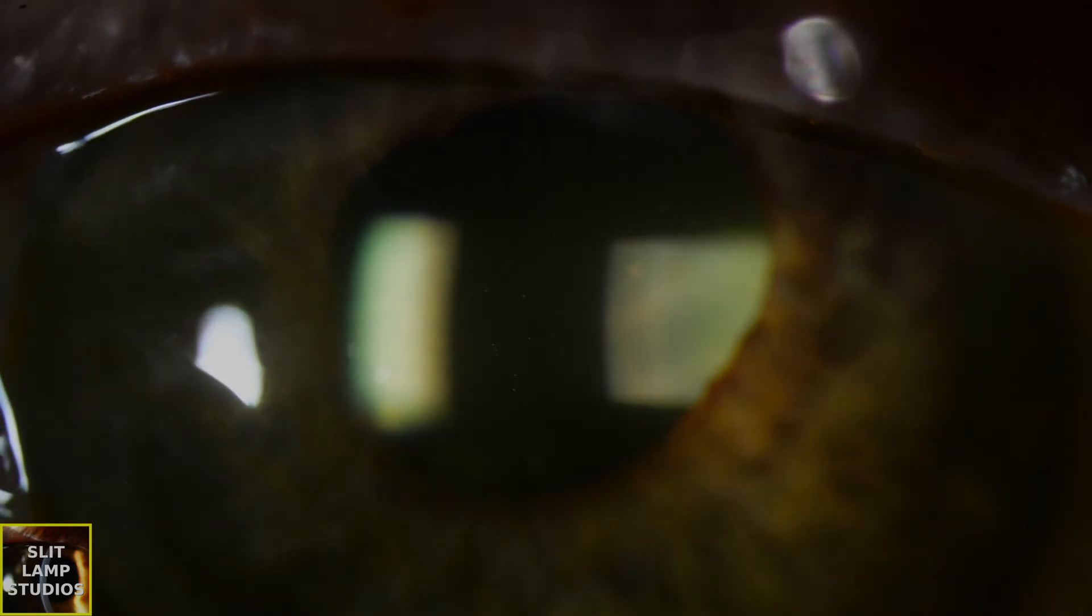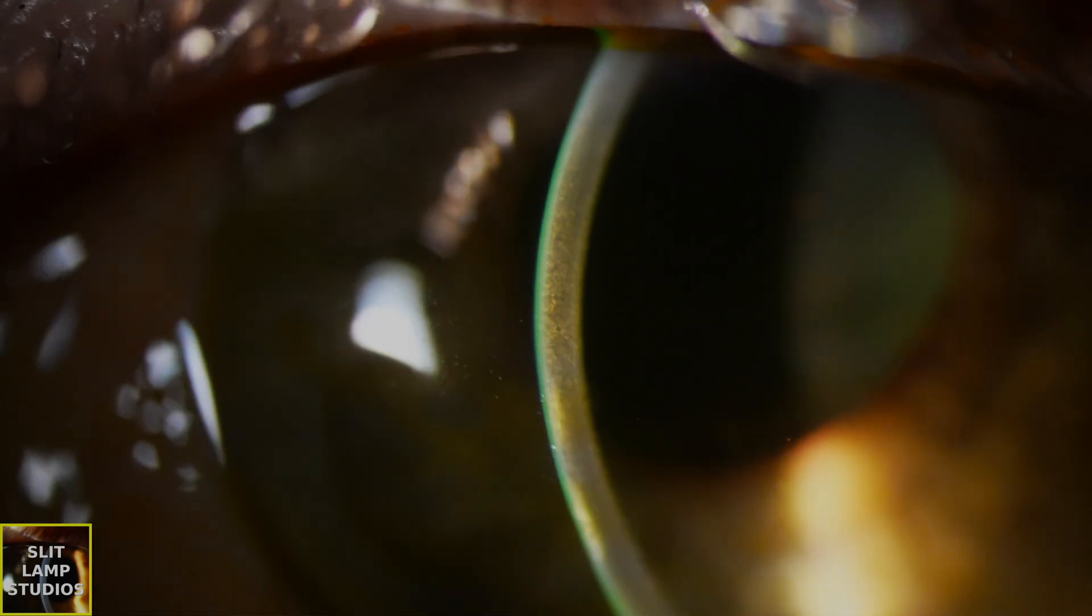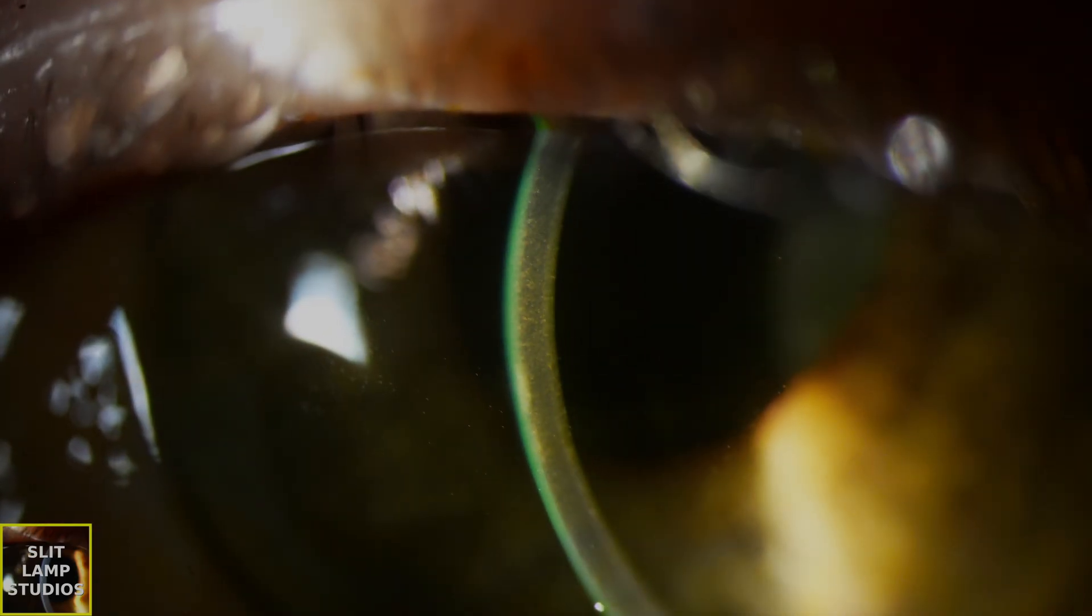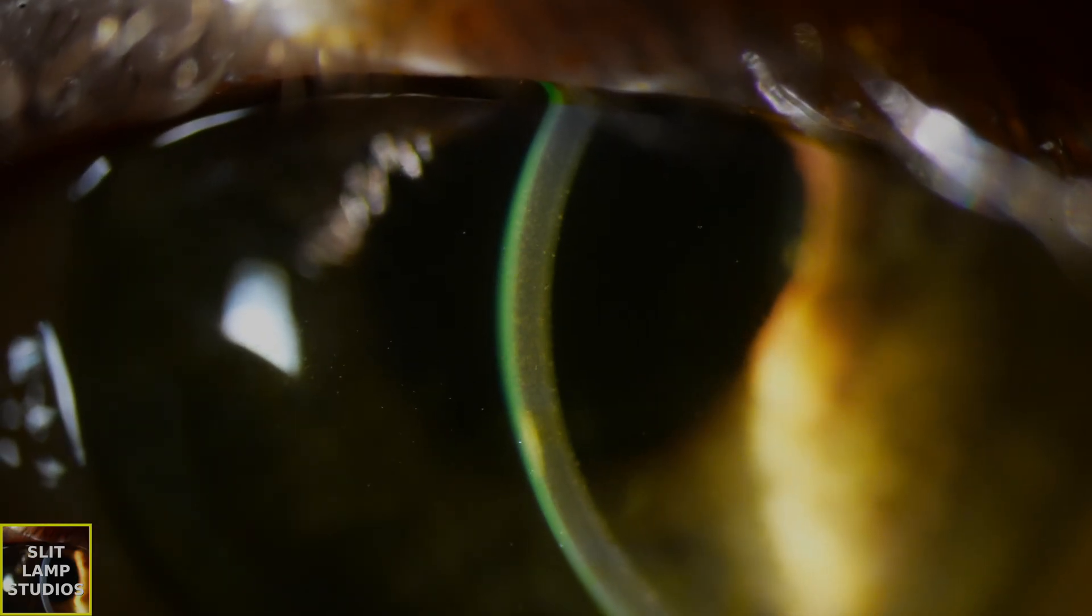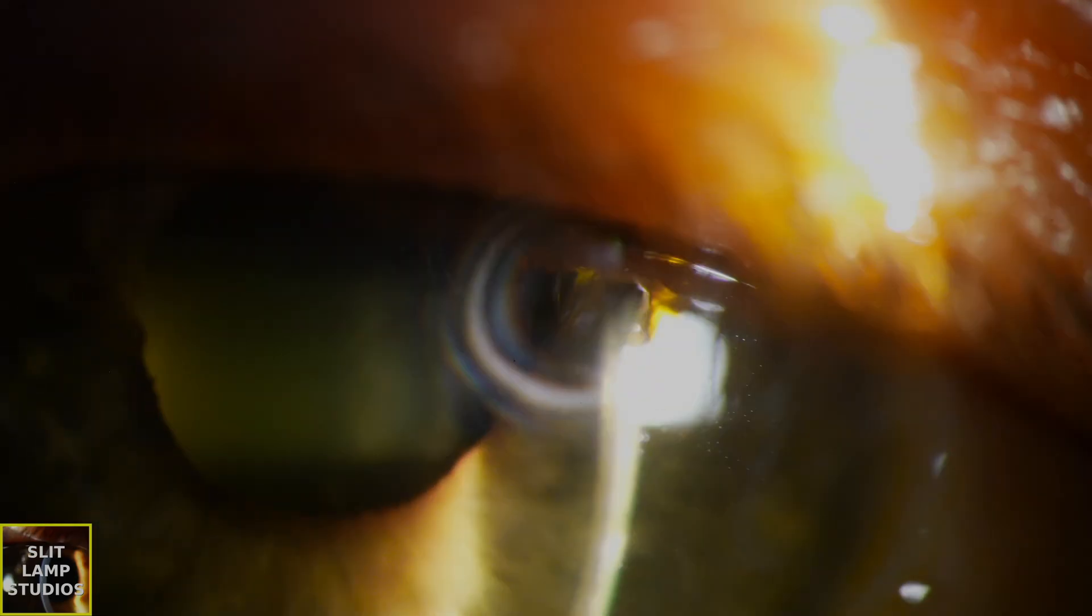So here we can see there is definitely AC inflammation, a good two-plus of cells. Sometimes there might not be that much inflammation. And this patient also has raised intraocular pressure because they've got trabeculitis, inflammation in the trabecular meshwork.